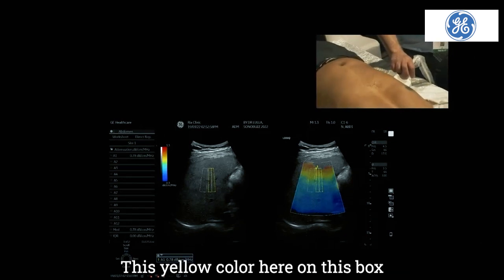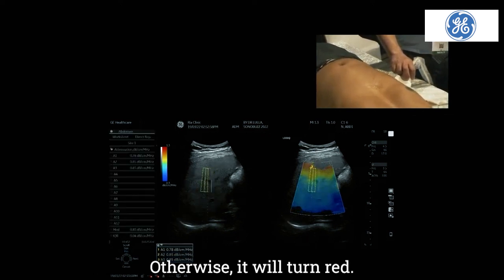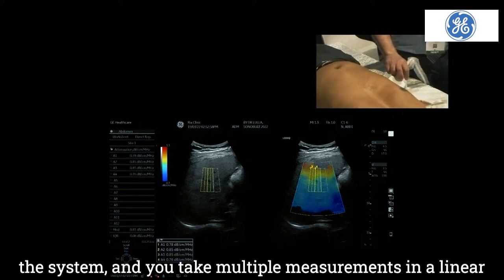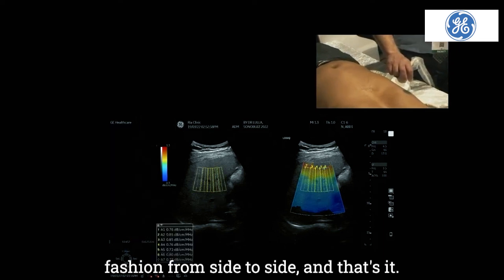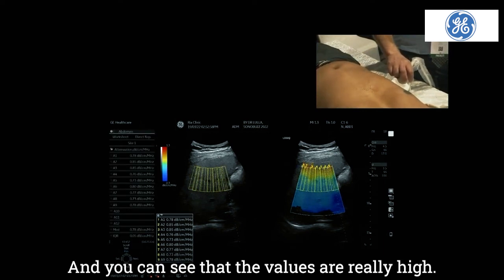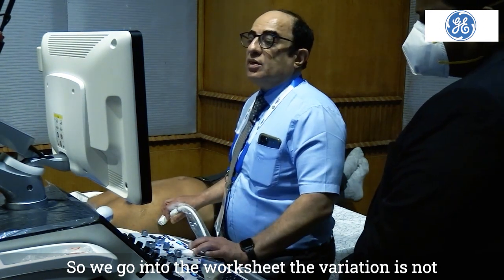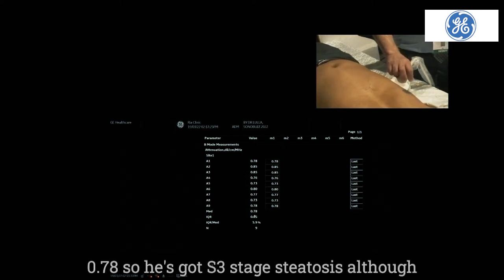This yellow color here on this box tells us that this measurement is reliable. Otherwise, it will turn red. So there is a quality control that is inbuilt into the system, and you take multiple measurements in a linear fashion from side to side, and that's it. We are almost done, and you can see that the values are really high. So we go into the worksheet. The variation is not more than 5.9%, and your average value is 0.78.